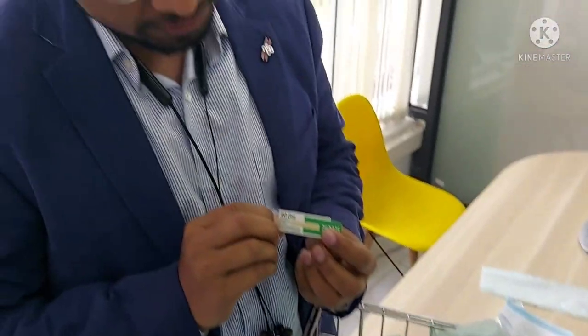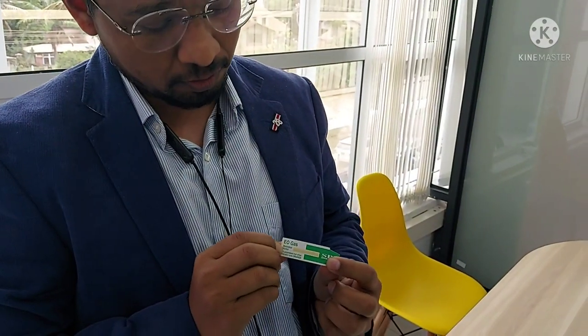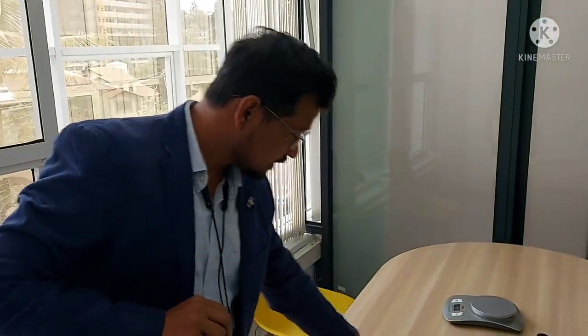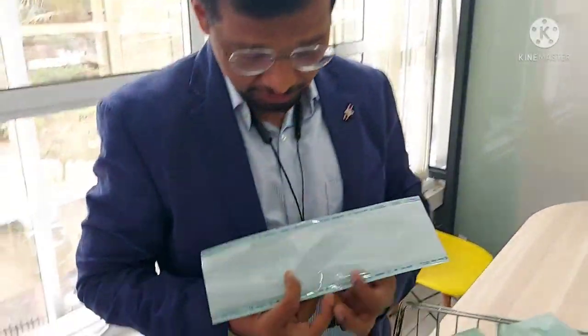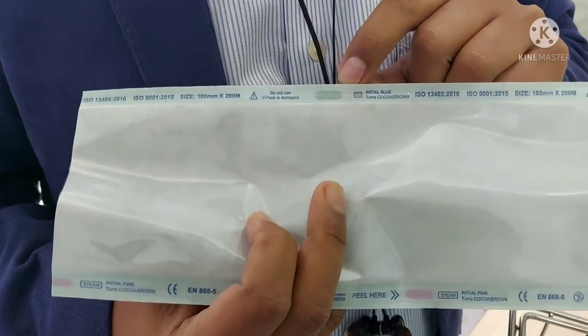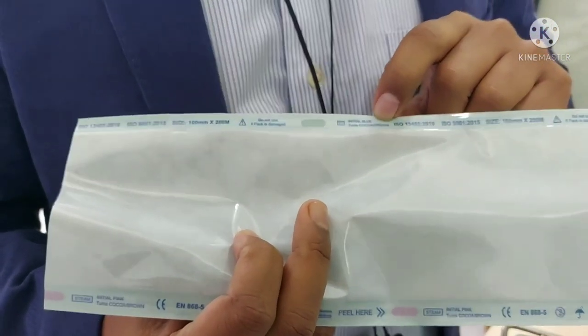So this is the gas indicator, EO gas indicator, which shows a yellowish color, which turns brown after the complete sterilization. And these are the indicator colors here. One which is the initial blue, which turns to the cocoa brown.